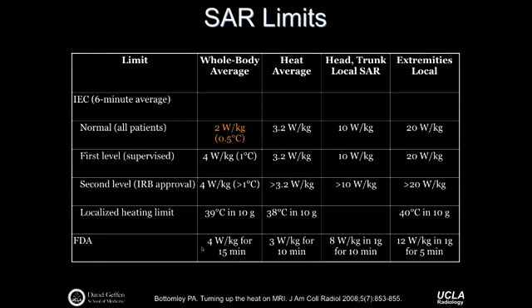You can, though, even while operating within the limits, easily have people say, wow, I felt warm, at the end of your scan, at the end of that half hour, that 45 minutes. So I think the modeling community that supports industry, and the FDA, have done a pretty good job of identifying where the limits should lie so that it's safe for everyone and yet doesn't limit performance too much for the system.